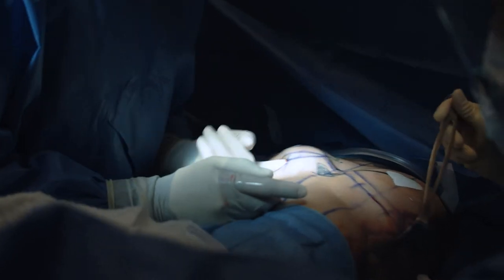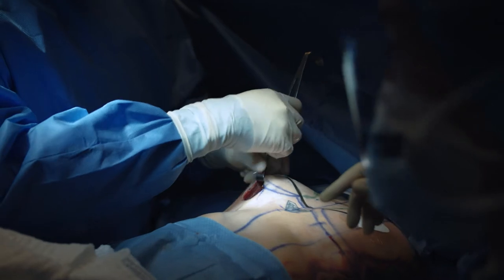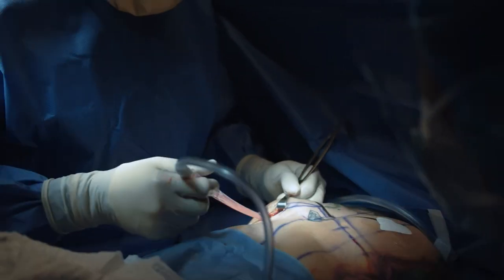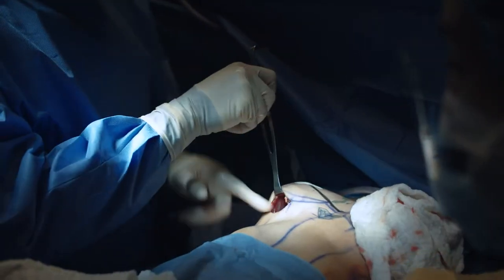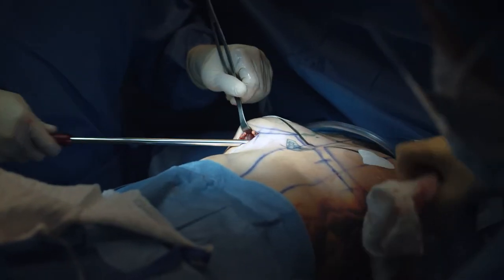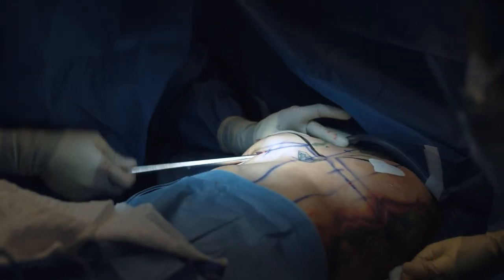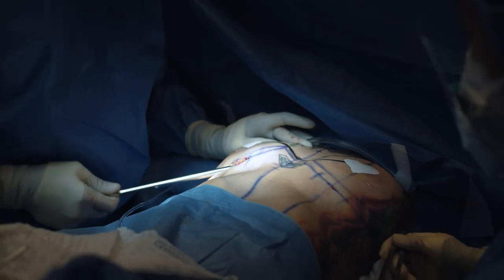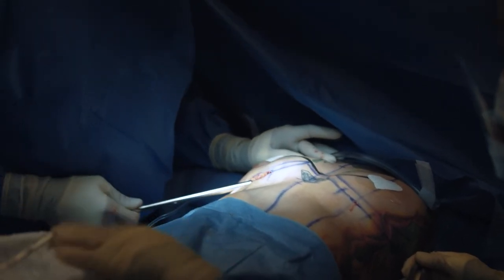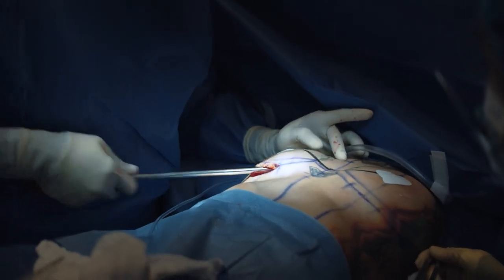Now we have to make sure we create cleavage for her. Suction. Now we're going to release up to the attachment of the muscle. But we've got to leave the muscle intact, otherwise we've got a uniboob. See, all the way, as much cleavage as I can give, even beyond if I get a little bit more.